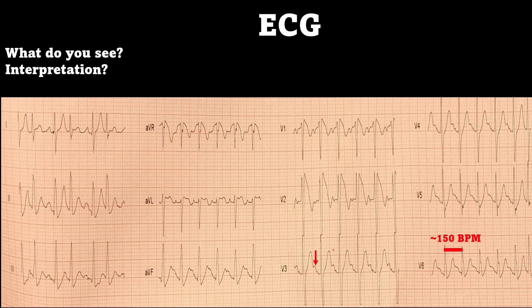First off, we can see the heart rate is about 150 beats per minute using the big box method. You can see the arrows in V3 show some kind of atrial activity as well. And in V1, you have an RSR prime — a pseudo right bundle branch block. In leads 1, 2, and 3, you can see these premature beats occurring before the next scheduled beat with no P wave associated with them.